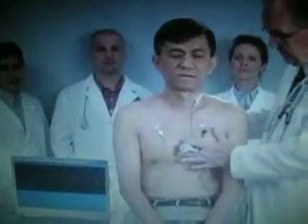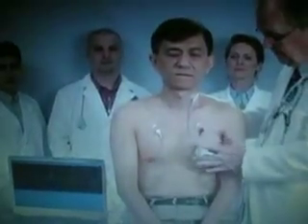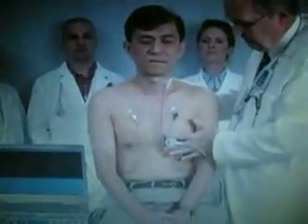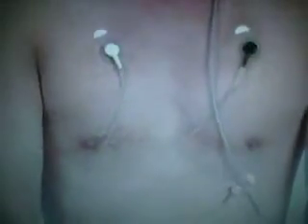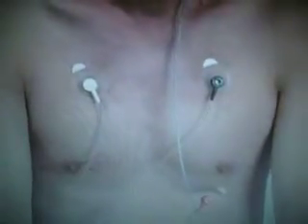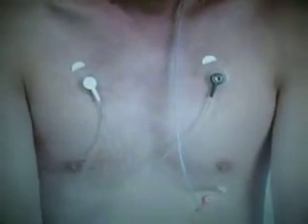The CardioSim has a powerful patient auscultation system that allows students or teachers to record, store, manipulate, and play back sounds from individual patients for use either as study aids or as material for the classroom. Optional patient inputs include a 3-lead patient ECG and pulse recording transducer. This feature offers institutions equipped with the CardioSim an unmatched ability to capture the variety and depth of the patient world and bring it back into the classroom environment.